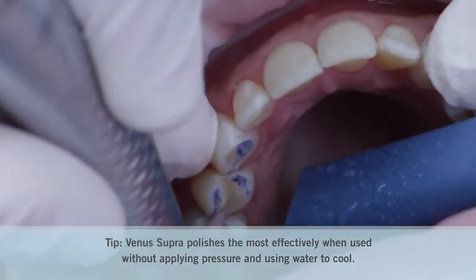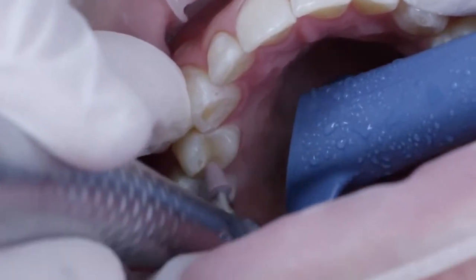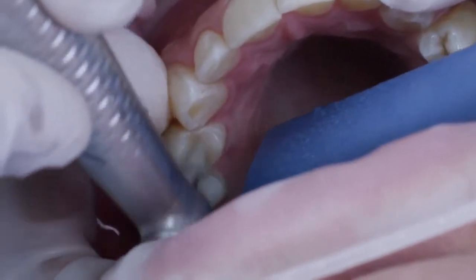Pre-polishing was now performed using the pink Venus Supra pre-polisher, and the entire area was then polished to a high gloss using the gray Venus Supra high gloss polisher.